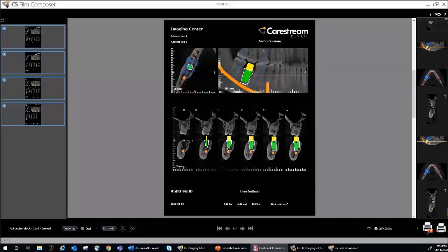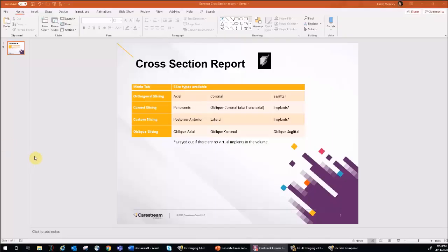To begin, we must decide which type of cross-section we would like to create. The options vary depending on which mode tab is selected. For orthogonal slicing, you can choose axial, coronal, or sagittal. For curved slicing, you can choose panoramic, oblique coronal, and implants.